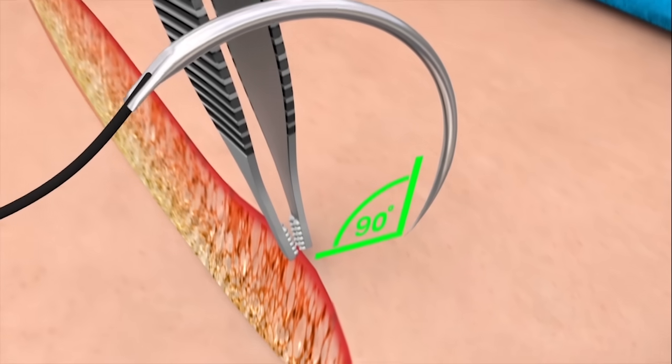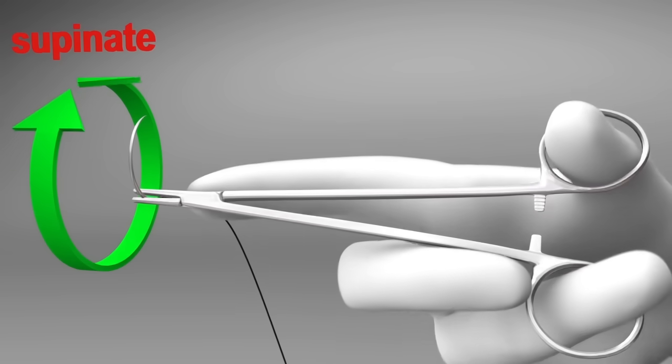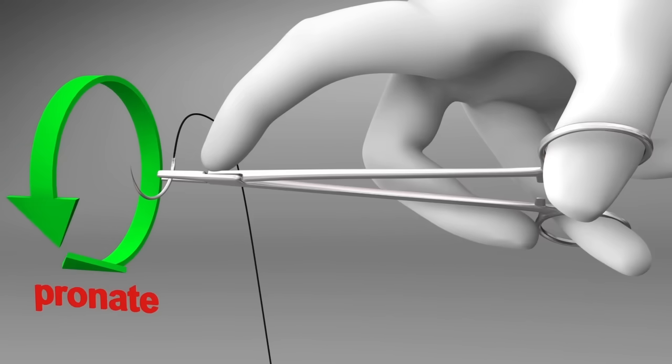Insert the needle with the point at 90 degrees to the skin. Rotate the needle smoothly through the skin by supinating the forearm.